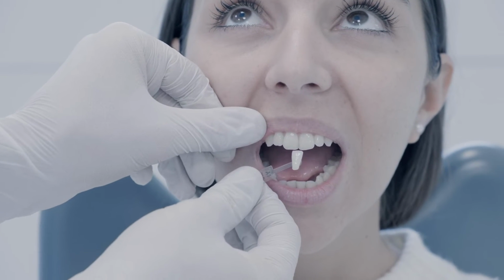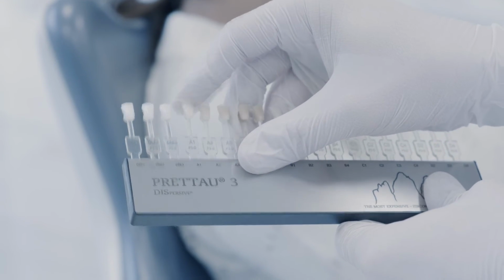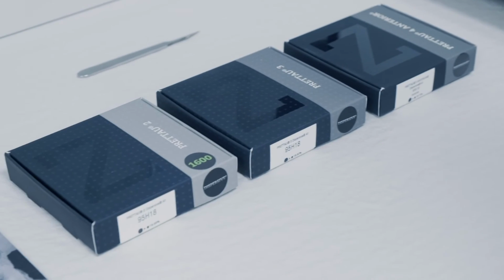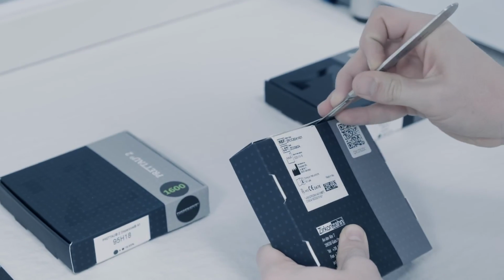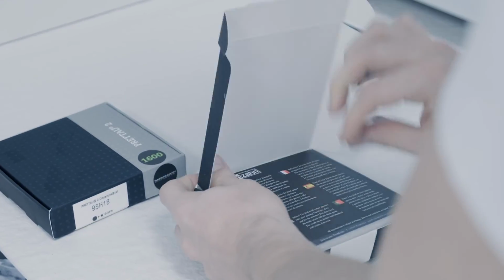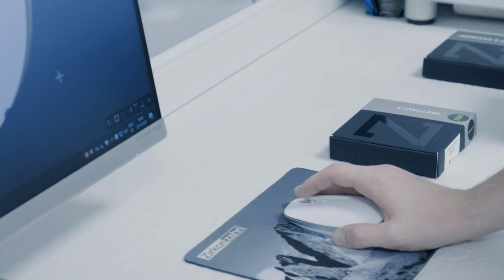An exact determination of the natural basic tooth color is fundamental for the artificial reproduction. Professional literature recommends always using the shade guide of the material that will later be used for the restoration. If the material of the shade guide and the material of the zirconia crown are identical, the color of the zirconia restoration will surely correspond 1-to-1 with the natural tooth color of the patient.